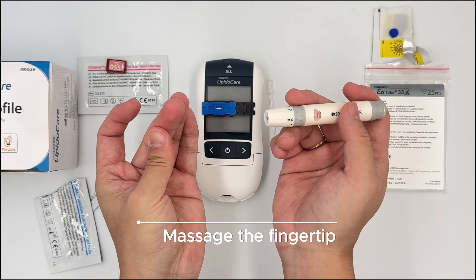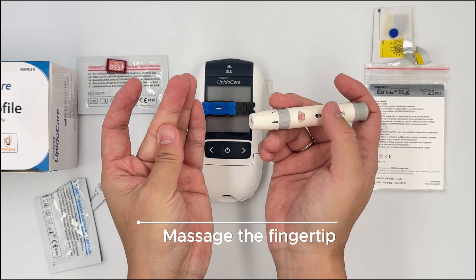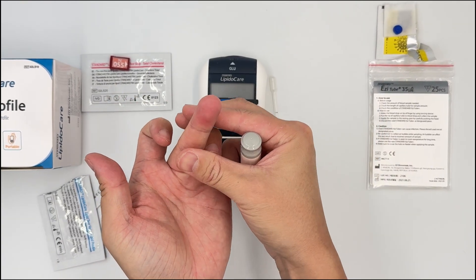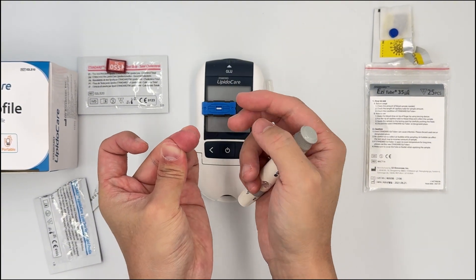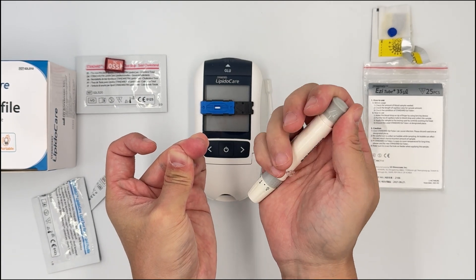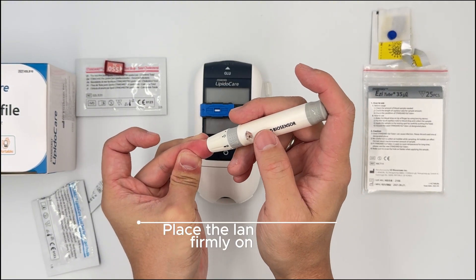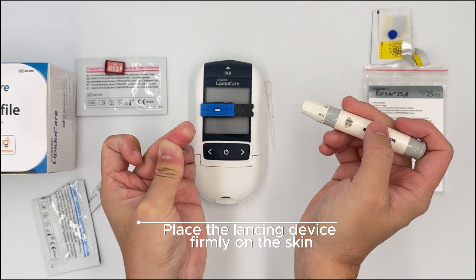Massage the finger — you can see it becomes a bit reddish. Hold the finger with two fingers. Once you hold it for five seconds, this area becomes a little numb and the patient will feel less pain when you prick them. Hold for five seconds, put the lancing device firmly on the skin — do not be loose — and click.